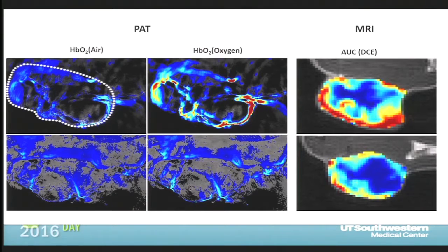And these are the corresponding photoacoustic tomography results. Just to remind you, the images I showed in the introduction are from a mouse, and these are actually rats. This whole area is a tumor. You can see the multi-nodule structure and very high peripheral perfusion. This tumor is about 2 centimeters across. The top panel is the baseline, and this is after VDA, after the vascular disrupting agent.